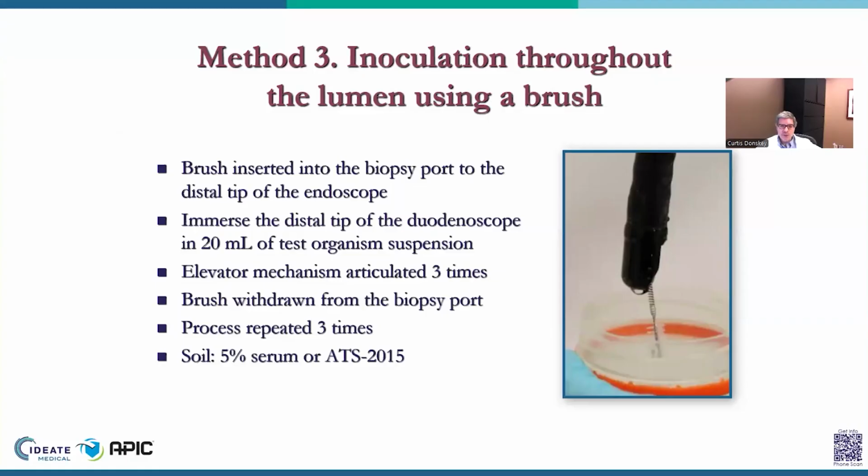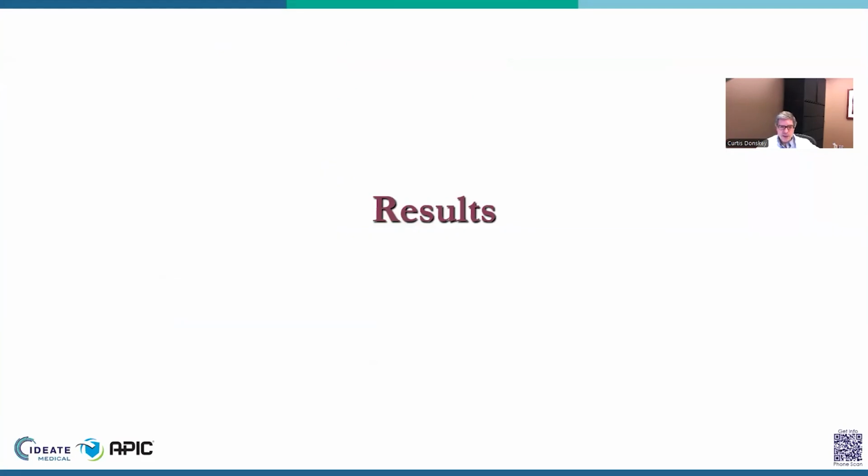And then finally, we did one final super challenge where we inoculated throughout the lumen using a brush. We inserted this brush into the biopsy port, passed it, immersed the distal tip of the duodenoscope in the test suspension, articulated the elevator mechanism, then withdrew the brush from the biopsy port and repeated that process 3 times, again with soil load being used.